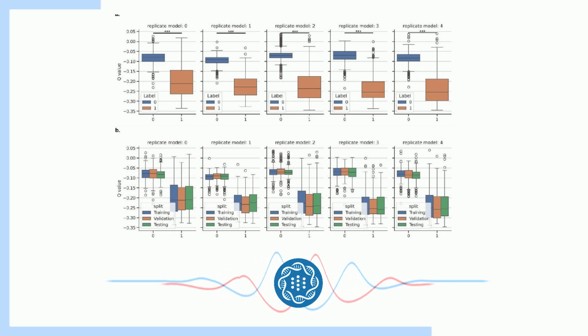Catchy. So what's special about this particular data set? Well, it's a huge collection of fundus images, over 1,200, and each one is labeled indicating whether or not that eye has signs of pathological myopia. So they basically gave Fundus2Globe this whole bunch of new eye photos and said, okay, tell me which ones have pathological myopia.